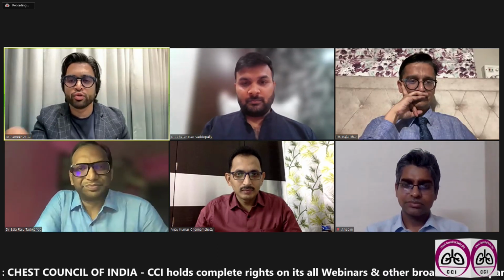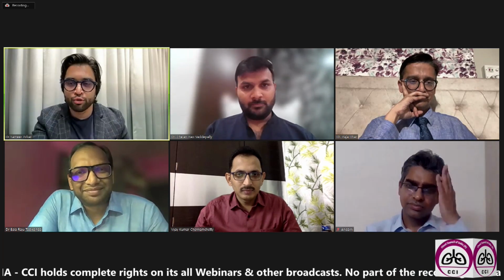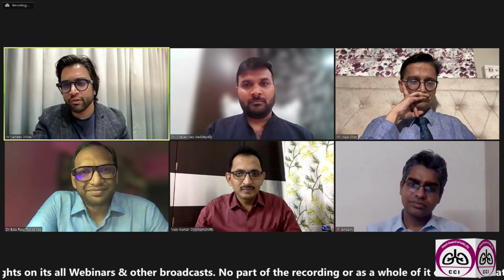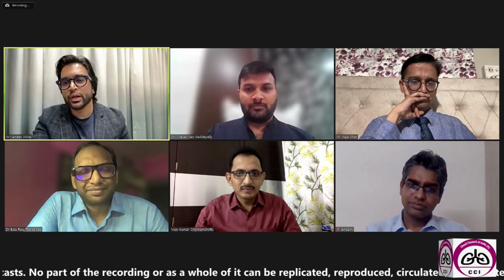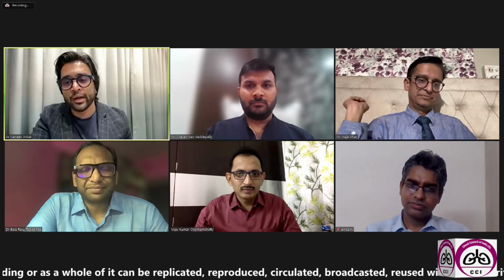But I would say anybody who wants to do cryo or anything related to this should dedicate at least 6 months or 1 year of their training to a certified interventional pulmonology course. I don't know if it was good or bad for us, like Dr. Bala said. We devised our own techniques. We went through putting two bronchoscopes inside and then understanding that an endotracheal tube works better. As of now, if you want to go ahead the right way, you should go for proper interventional pulmonology training, because if you cannot dedicate these many months to the art of interventional pulmonology, you'll end up causing more harm to the patient.